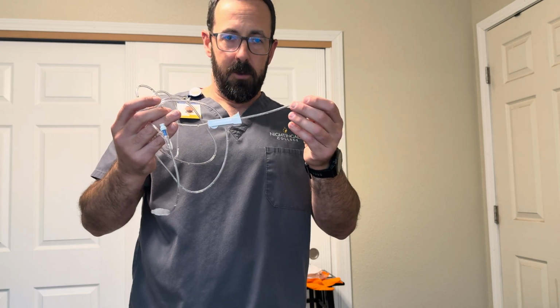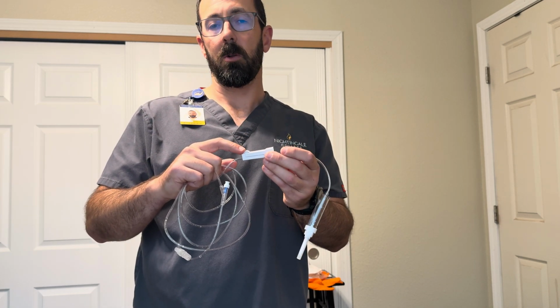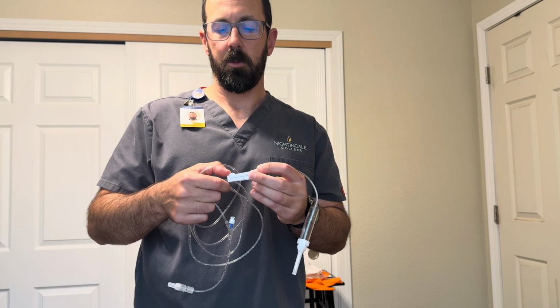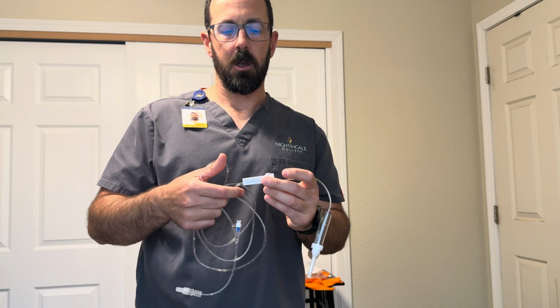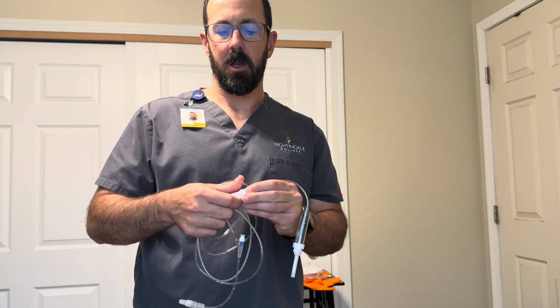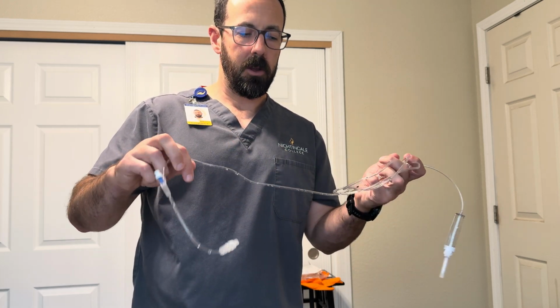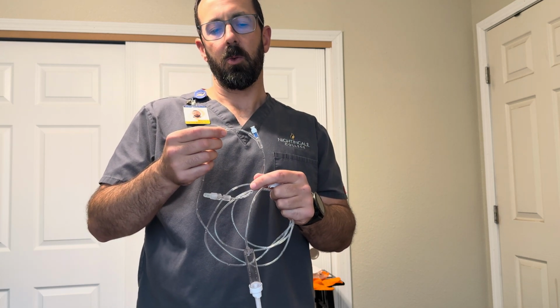This is IV tubing, and this is my IV clamp, roller clamp, or just clamp. Pulling it all the way down so it's tight and pinching the tube close to the clamp, rolling it forward, opens it up all the way for max flow. When I control the rate, I'm going to adjust the clamp accordingly to control my drop rate. Continuing down the IV tubing, you have your Y tubing or Y port.